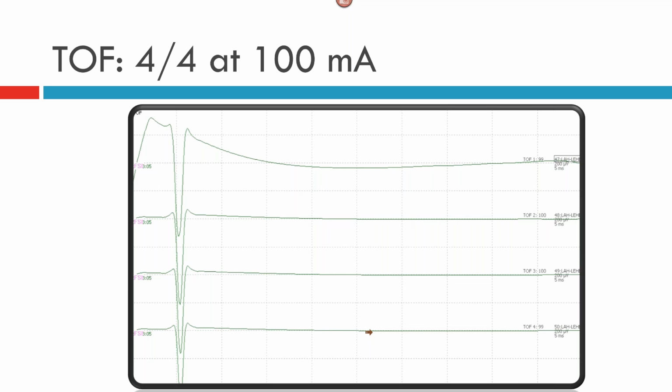And if you stimulate through skin, you should get a response at less than 10 milliampere, or 5 or 6 milliampere. If you try to stimulate yourself, you can start feeling within 4 or 5 milliampere, and after 10 milliampere, you start getting cut off.